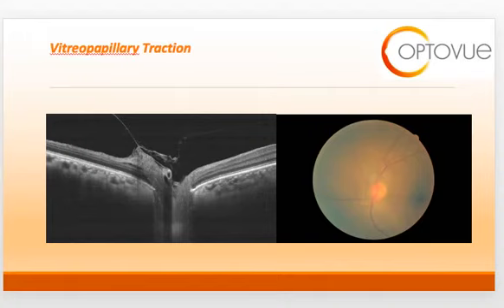So this video hopefully served as a nice introduction to diseases of the vitreomacular vitreopapillary interface. And again, it will serve as a tutorial as we move forward into more advanced interpretation of vitreoretinal disease.